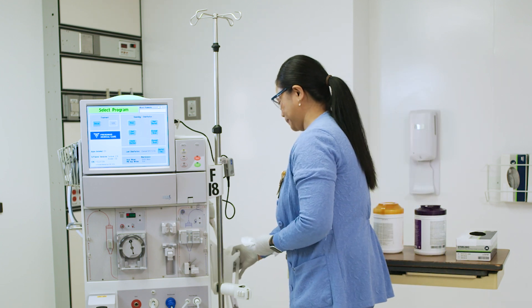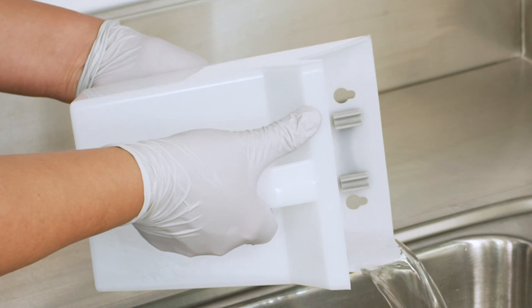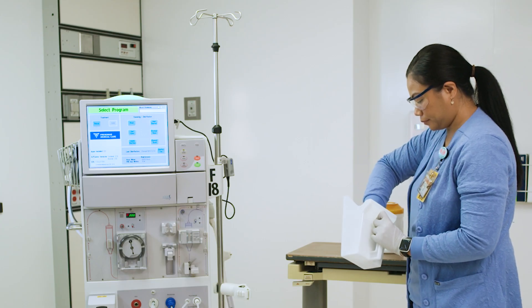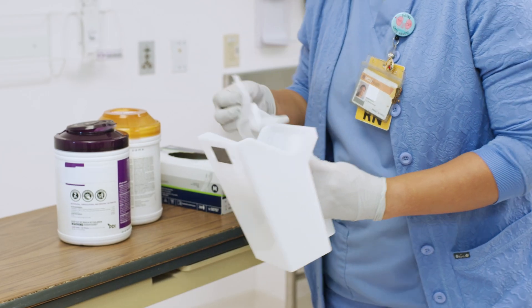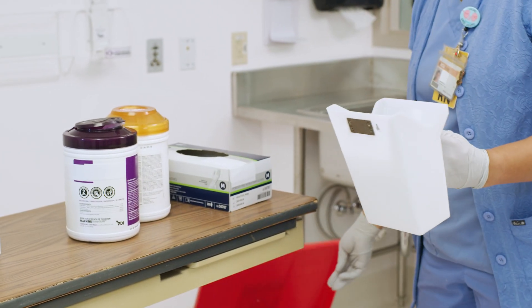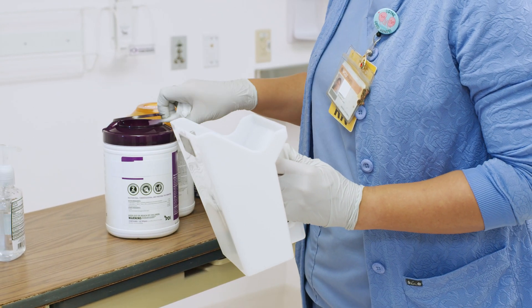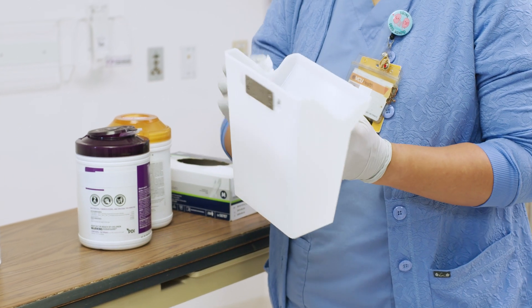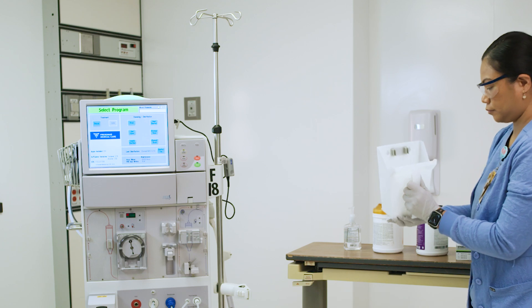Start disinfecting the machine by removing the priming bucket from the side of the machine. Dispose of the contents in a toilet or other approved drain. Using a disinfecting wipe, wipe the inside, sides, and outside of the bucket following the manufacturer-recommended wet times. This may require several wipes. Once all surfaces have been properly disinfected, set the bucket aside.